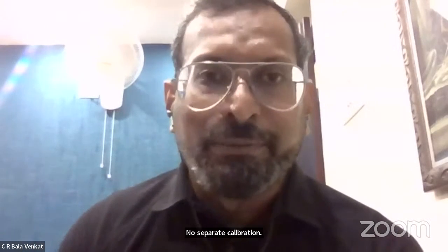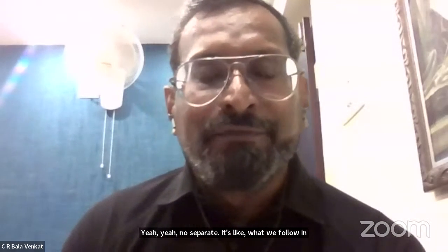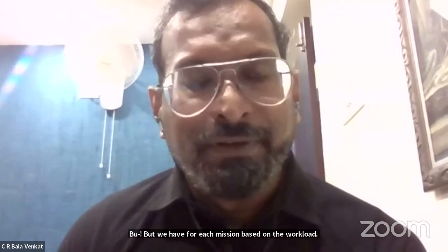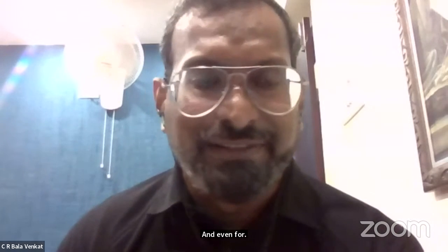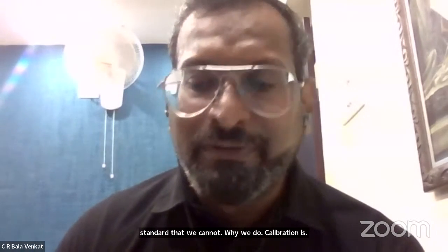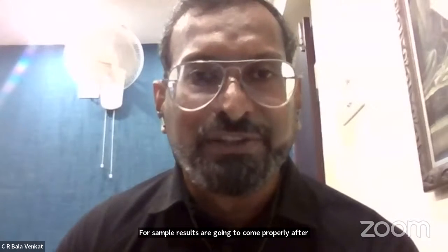No separate. It's like what we follow in a normal laboratory. But for each machine, based on the workload, if you take hematology, we have a separate calibration frequency. Similarly for biochemistry, and even for immunology, it depends. But the calibration is standard. Why we do calibration is to ensure our sample results are going to come properly. After calibration, we have to run quality controls to ensure that.